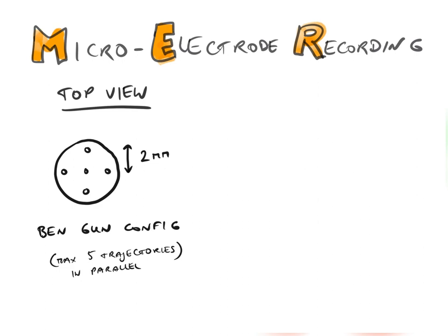The idea behind the microelectrode recordings, or MER, is you don't insert one electrode, but you insert up to 5, mostly in PD it's 3, microelectrodes to record, but also to stimulate, which means that we like the patients to be awake. You could do some measurements actually under anesthesia, but the best recordings and definitely the most useful stimulation effects we get when patients are awake.